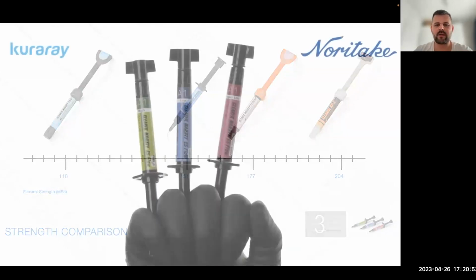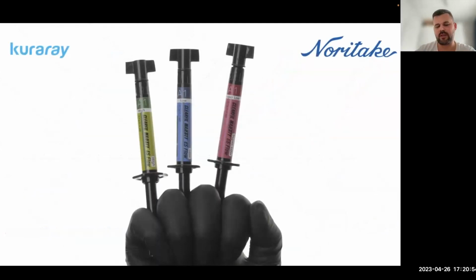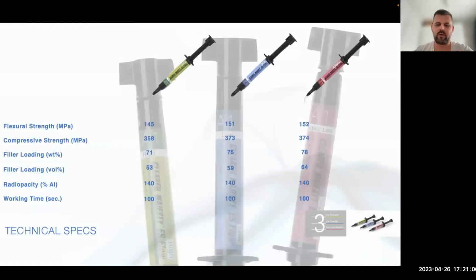But of course, you remember that we have three different densities of this composite: high, low, and super low. And we know also from the previous webinar that the properties of the composite depend on the fillers. If we have a lot of fillers, the composite will be stronger, better for the posterior region, more opaque also.